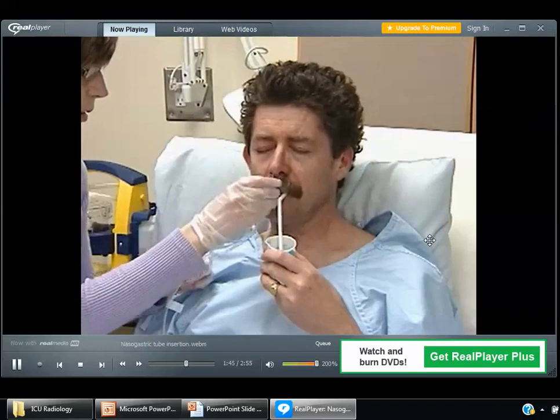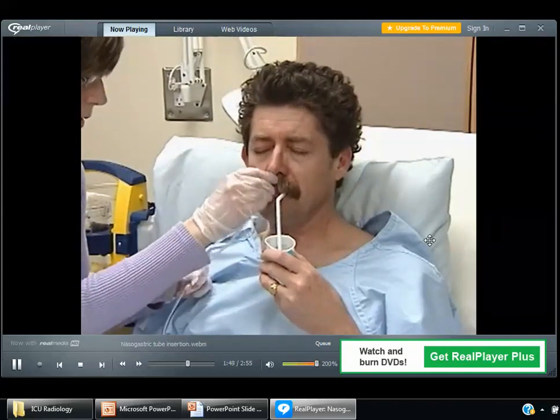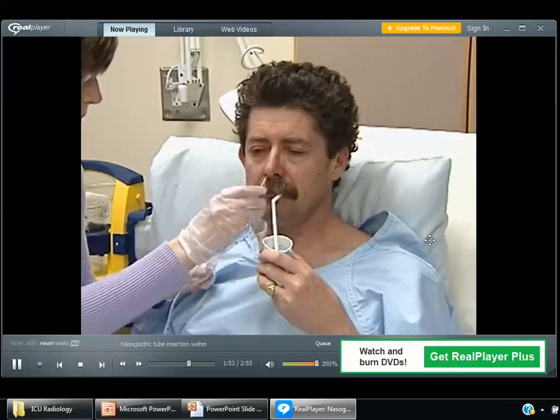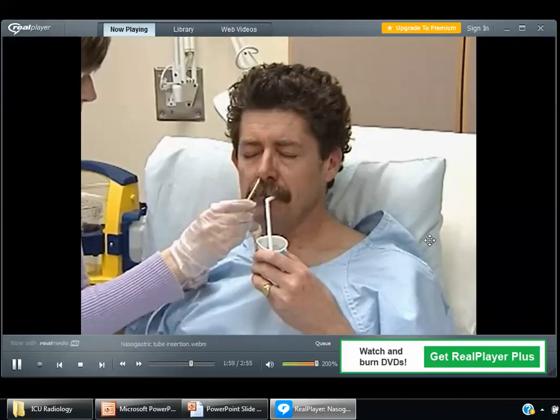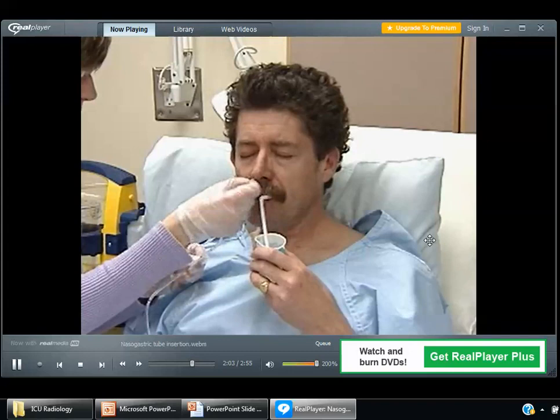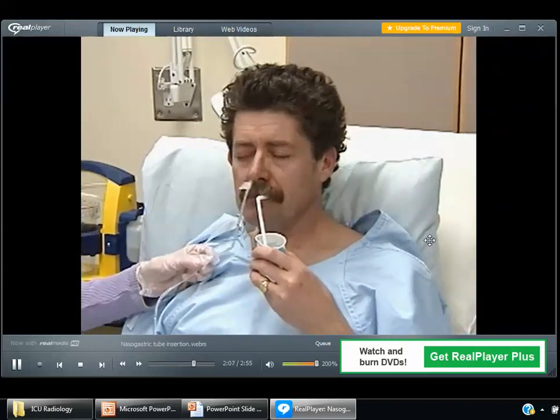The patient may cough or gag if the tubing has accidentally entered the larynx. You can pause, withdraw slightly, and ease the patient with a sip of water. Be careful, there is a risk of aspiration. Advance to the measured mark and anchor the tube to the cheek while you make sure the tube is properly positioned. Your patient should be able to speak.